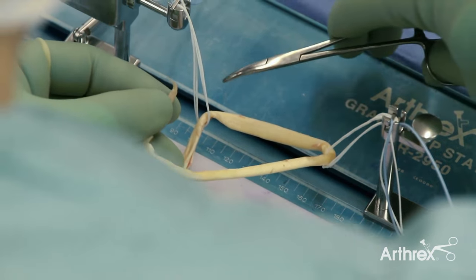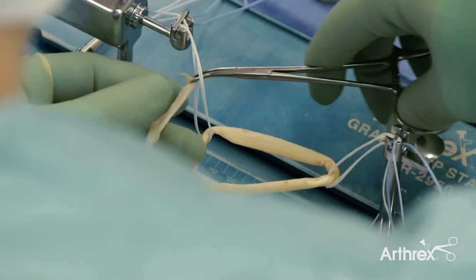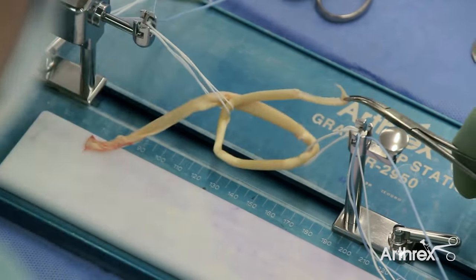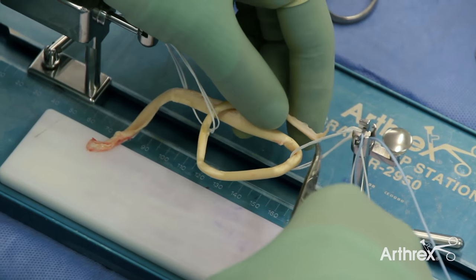The longer end is then brought back through both ACL tightropes to create a quadruple graft with two free ends.